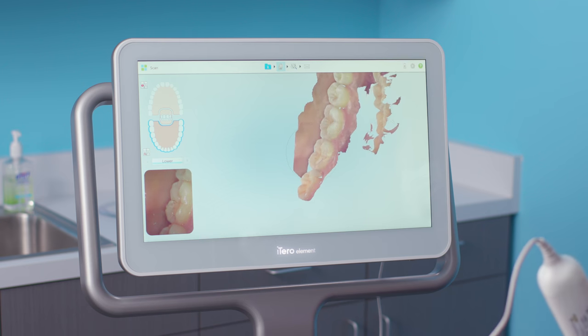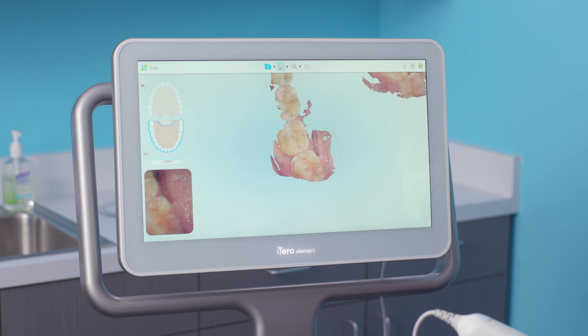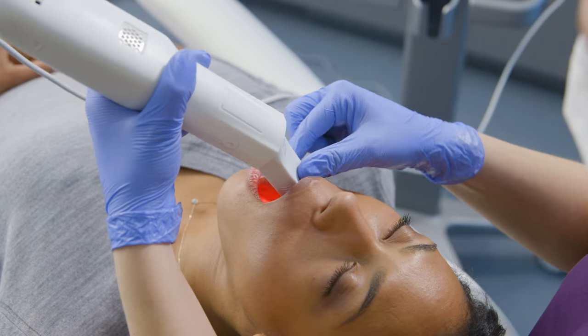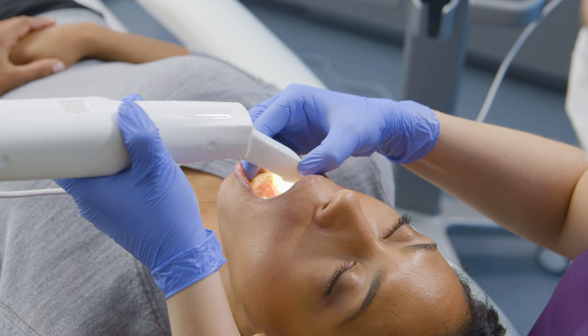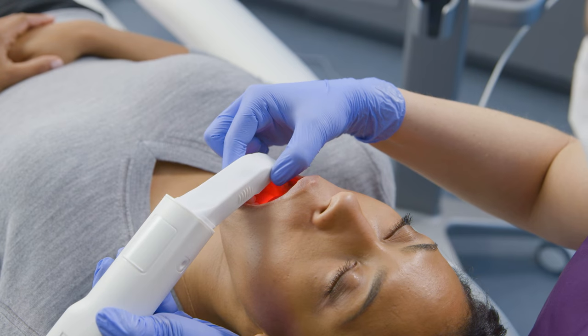I'm always careful to roll over the occlusal of the terminal tooth when I'm moving from the lingual to the buccal. This ensures that the model builds smoothly. While scanning the buccal surfaces, I orient the tip of the wand at a 45-degree angle to the buccal surface, with the cord end facing away from the patient.